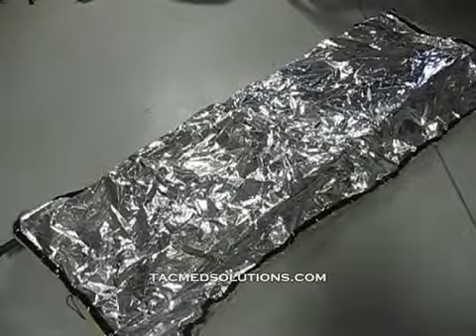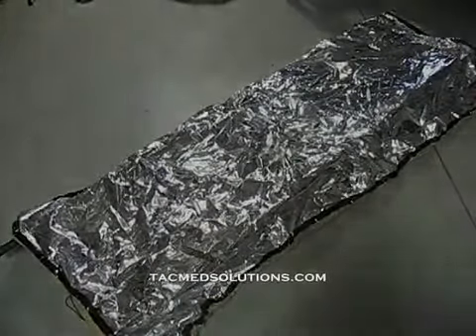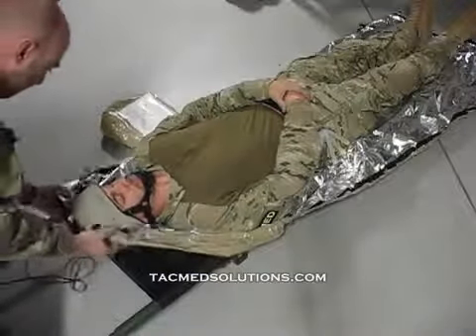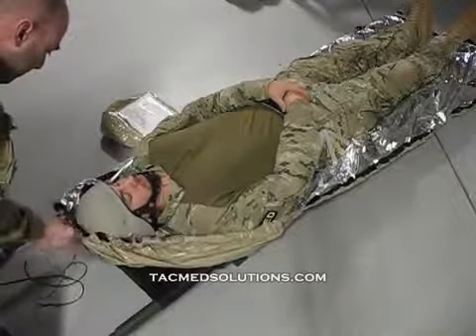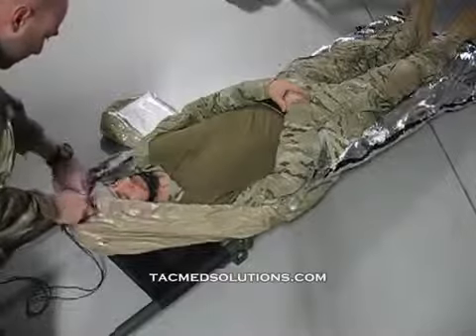To use the bottom sheet, it is laid flat on the surface of the litter. The casualty is placed on the bottom sheet and the cord is pulled to draw the sides of the blanket around the casualty. This also forms a hood and a cover for the feet.